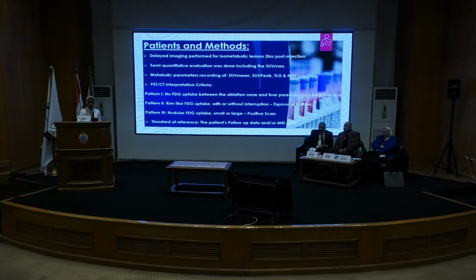Delayed imaging was performed when we encountered isometabolic lesions. Patients underwent delayed imaging 2 hours post-injection. Semi-quantitative analysis was done by the SUV max. Also, metabolic parameters were recorded.